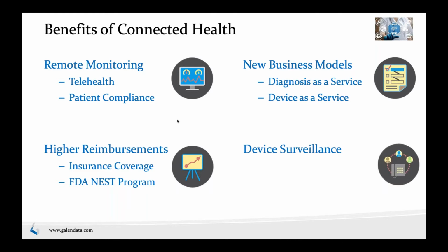Another thing I want to talk about is device surveillance. Connectivity can be useful to your engineering teams as well. If your device is connected, you can keep an eye on the device health remotely, and you can even do predictive maintenance on it if possible. Similarly, if there's an issue in the field, your engineers can get access to that data without having to go down and collect it, and they can diagnose a lot of those issues without even needing the device back. The same can happen if there's a complaint in the field, for example.